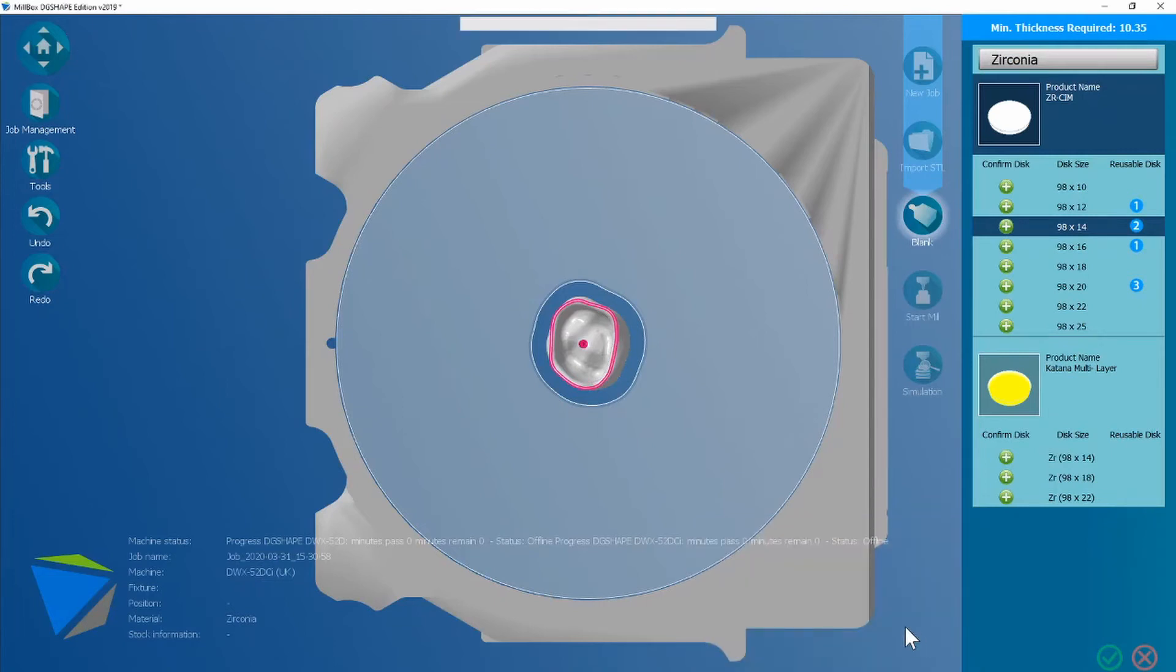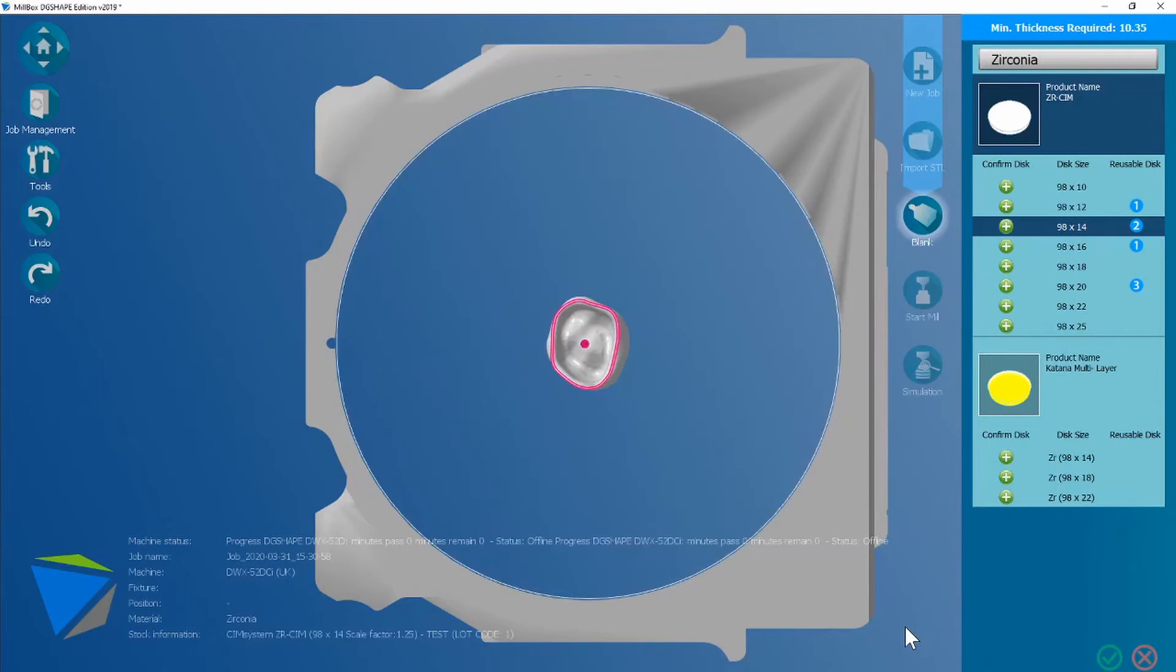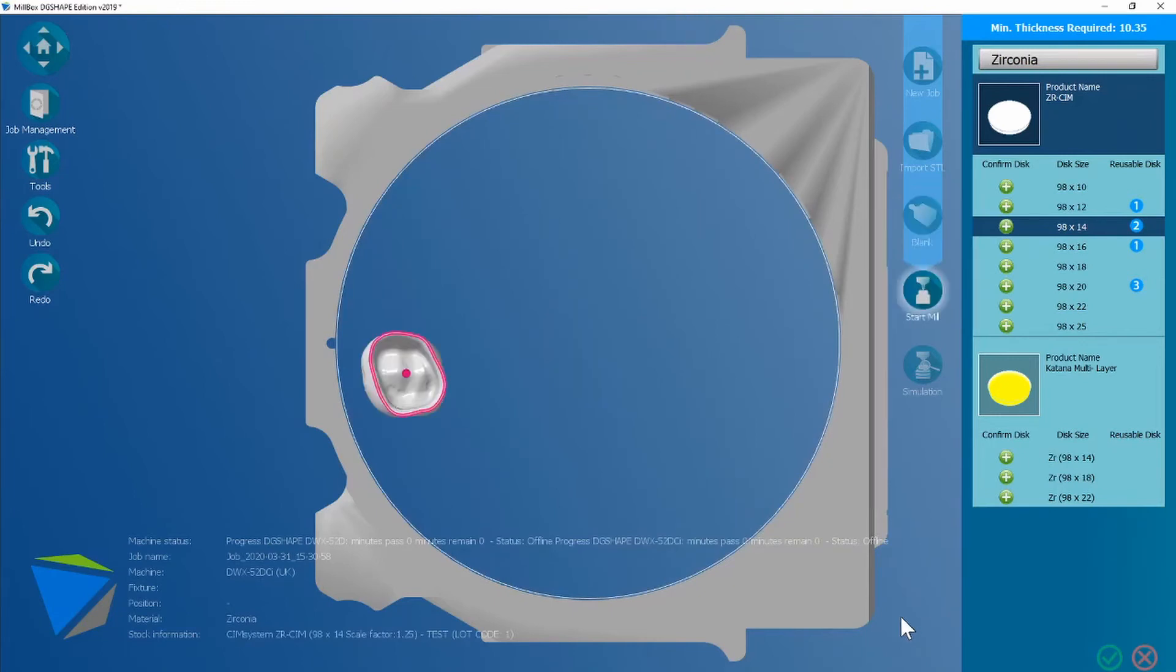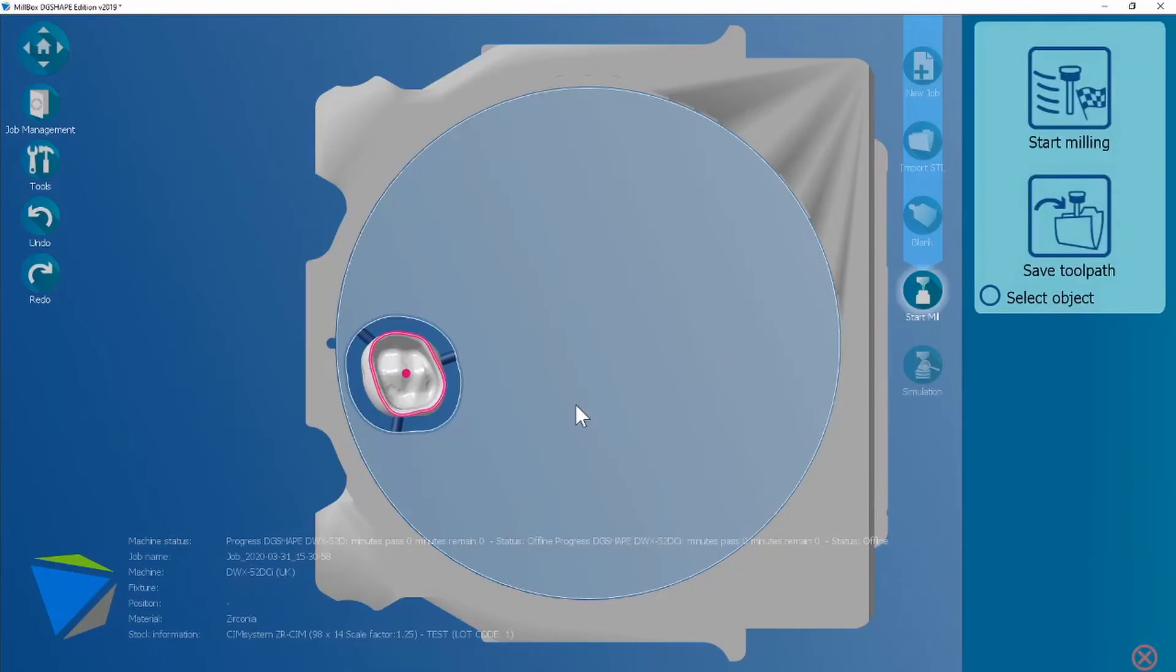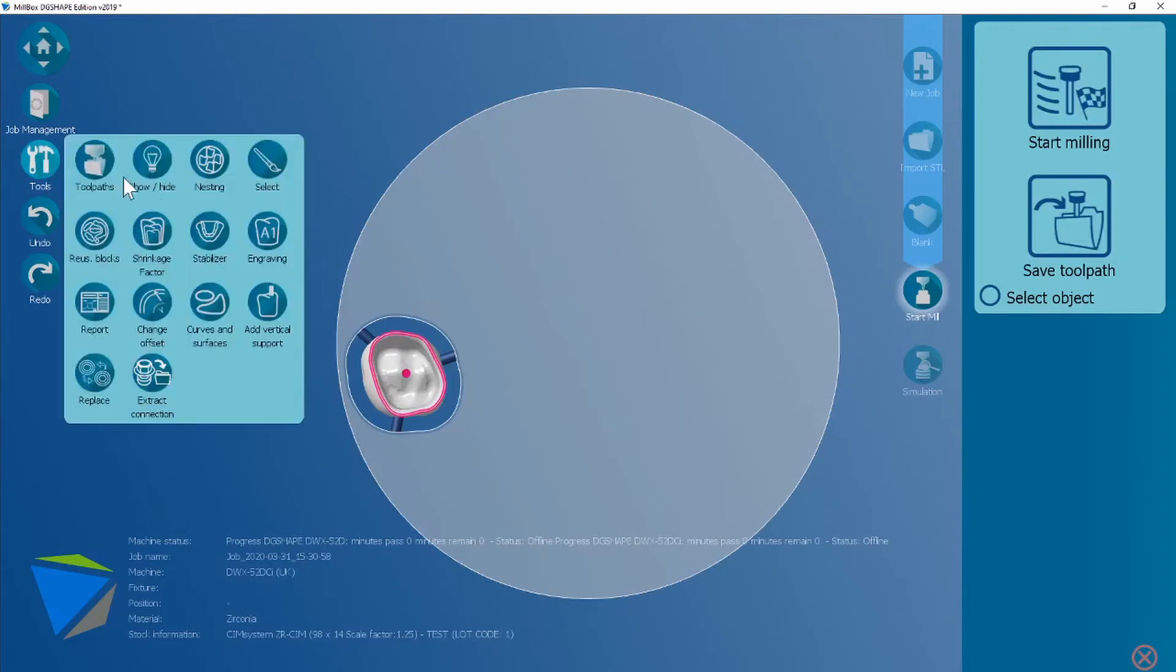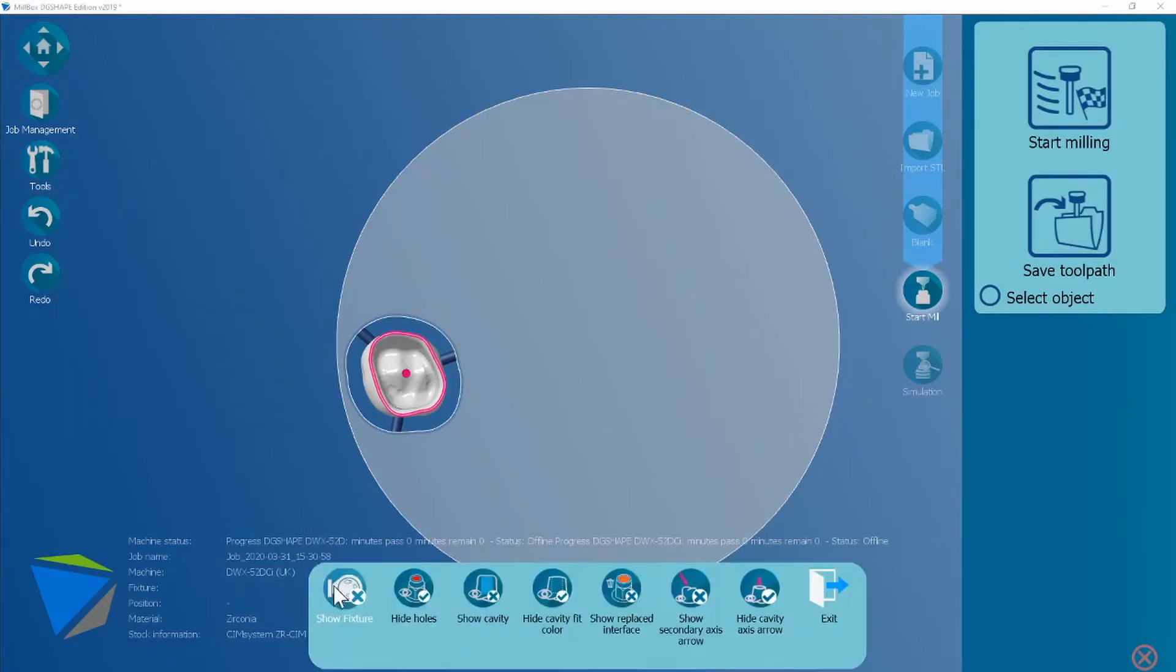Once you're happy it's going to automatically nest that crown within that disk. Using control E I can get rid of the equipment or within the tools show and hide and show fixture.